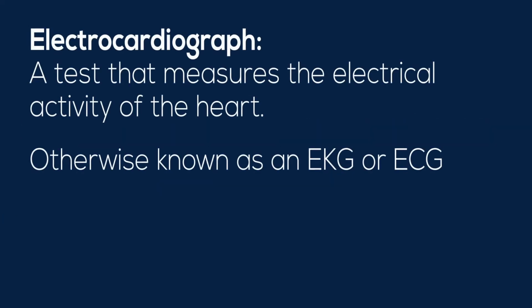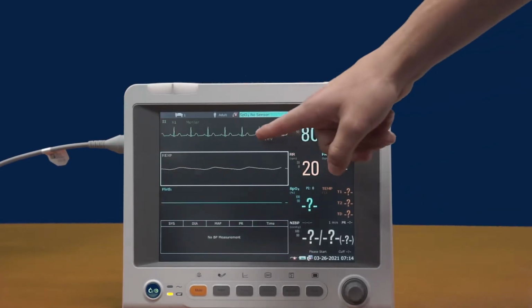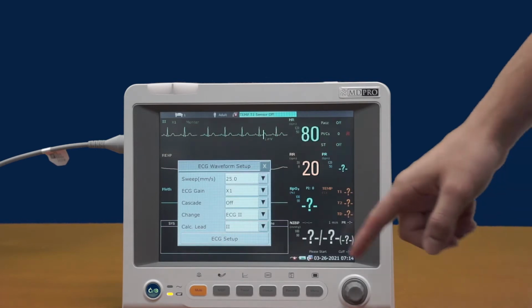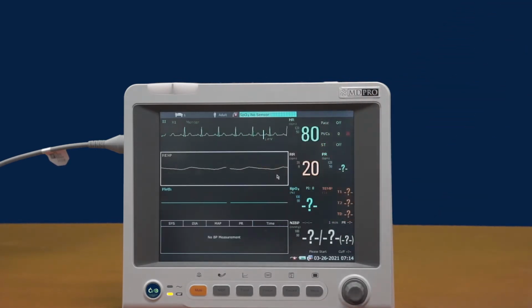Diving down further into this, EKG or an electrocardiogram, often abbreviated as EKG or ECG, is a test that measures the electrical activity of the heartbeat. With each beat, an electrical impulse or wave travels through and from the heart. A normal heartbeat on ECG will show the timing of the top and lower chambers.